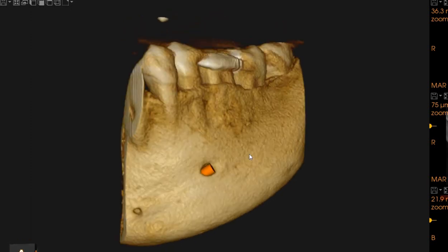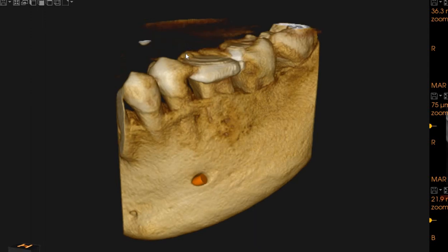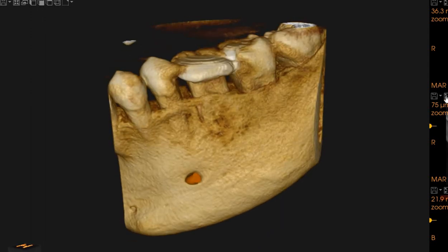Hello, Assalamu alaikum. Atra Scan Diagnostics here. This is the CBCT of the patient that you had requested. The area of interest is the lower left first molar.